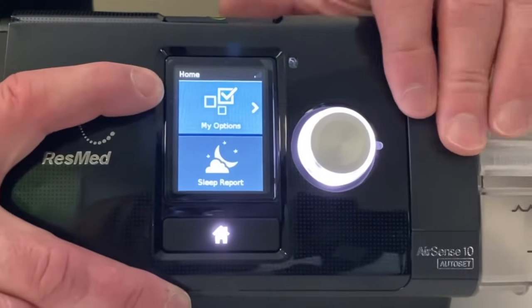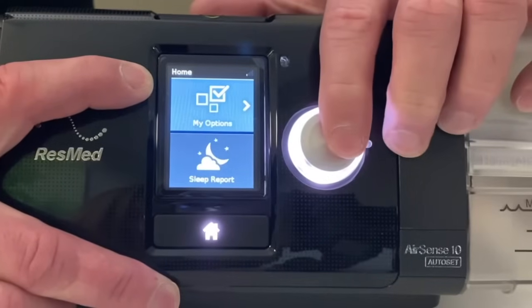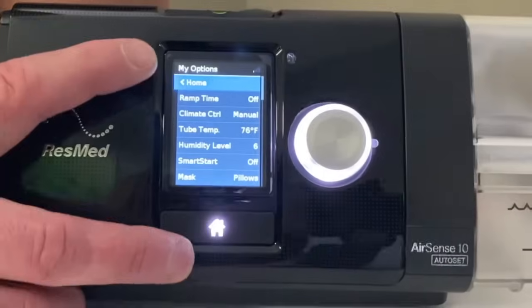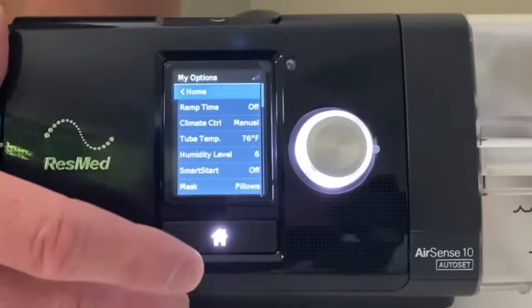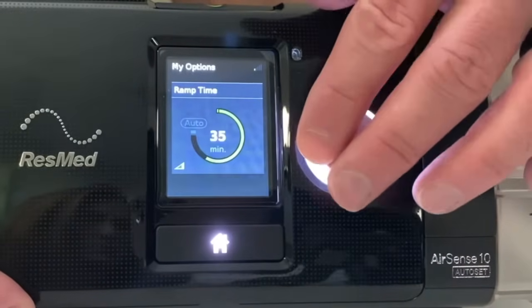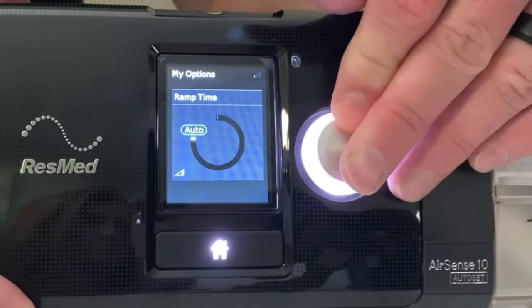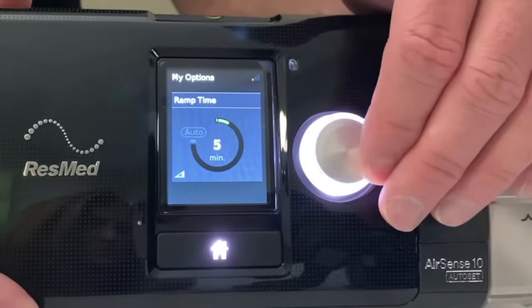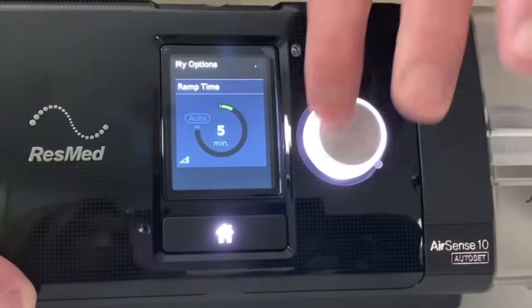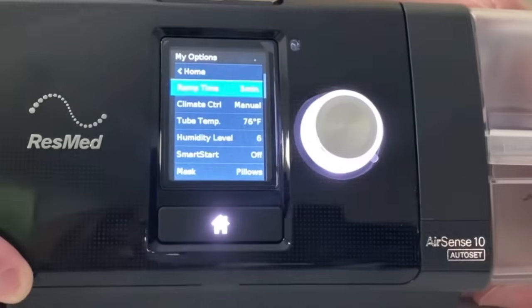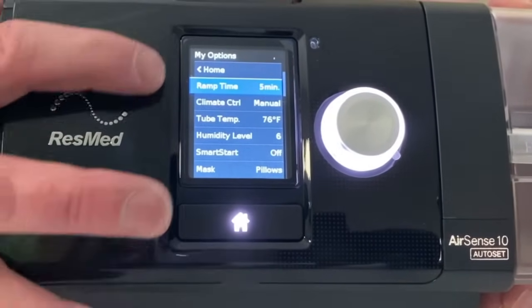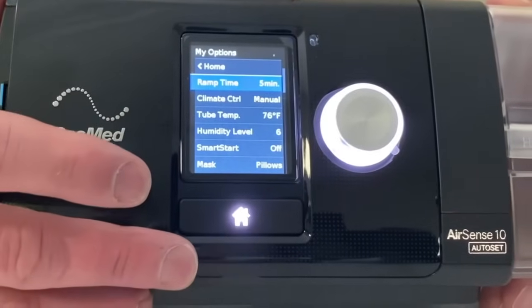Now let's go into the My Options menu. If you click on it, you've got your ramp time — that's how long it's going to take to go from a lower pressure to a higher pressure. You can twist and click it; it goes in five-minute increments and can go to auto. For example, if you're starting at a pressure of 6 but want to start at 5 and have it take ten minutes to work up to 6, that's what the ramp is for. It's a comfort setting — feel free to change it where you need.